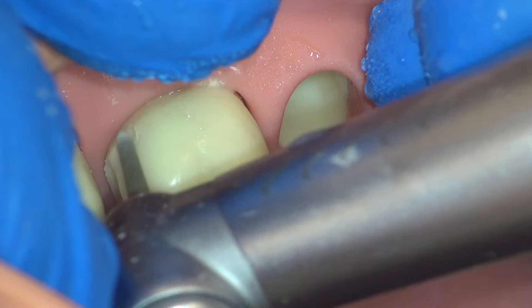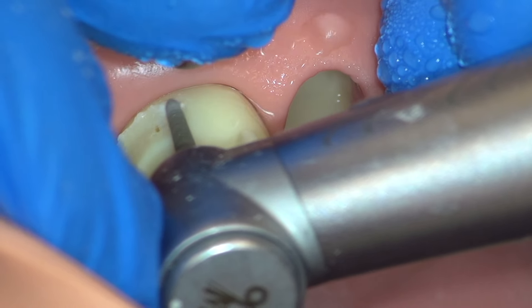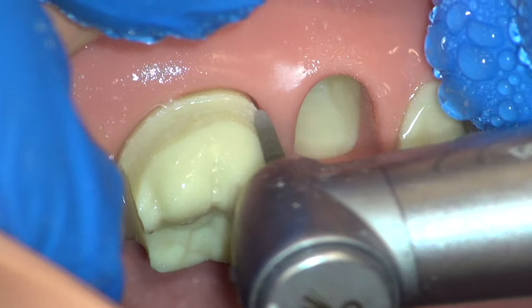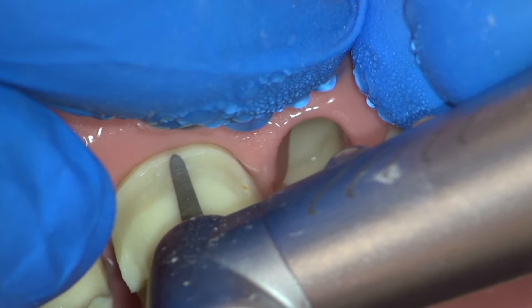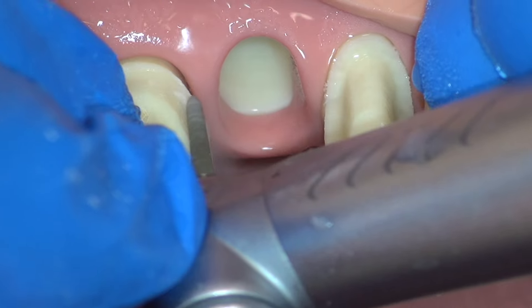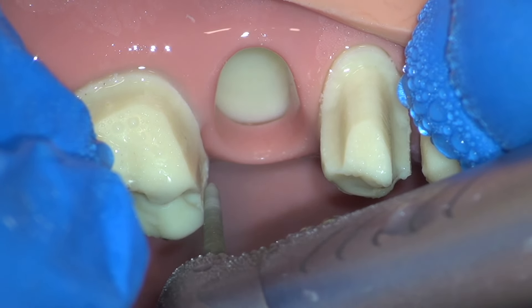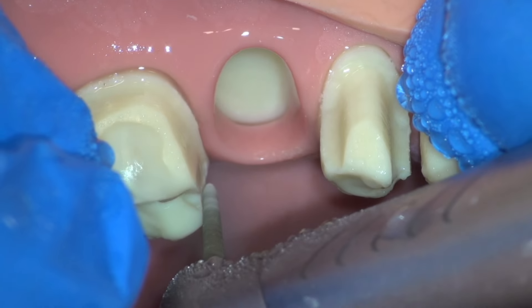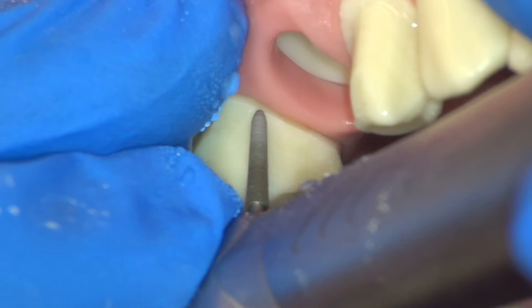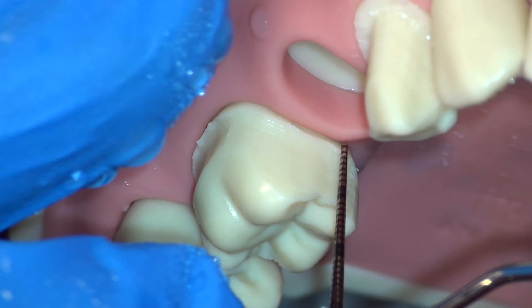Next, we can place our mock finish line on the buccal surface of the tooth, working from one side of the tooth to the other in a controlled manner. At this point, I am not worried about my buccal-lingual angulation; instead, I look at the tip of the burr to ensure the proper axial reduction. Continuing with our molar mesial axial reduction, consider the path of both teeth before beginning your cut. We can see that the premolar is tilted to the distal and we'll correct that later. We notice that the finish line is set more than half a millimeter supragingival, which is our desired measurement, so we will go ahead and set that to our final desired depth. We do not want to have to re-prepare the entire tooth multiple times.